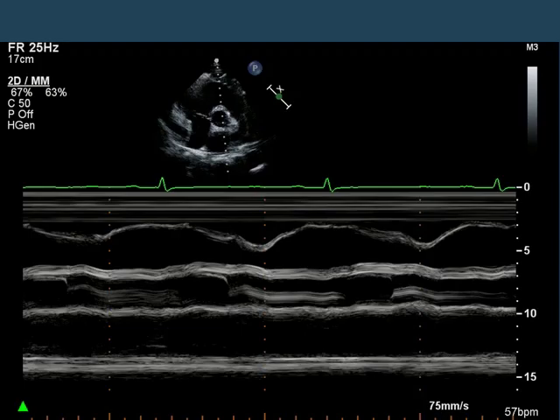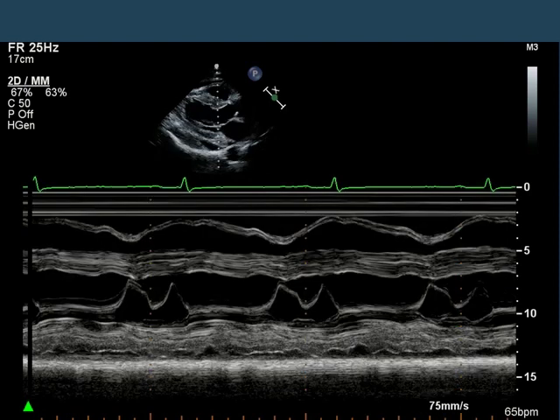You can see those again — just the M-mode. Take a look at where the aortic valve is closing, and see where the RVOT starts to come up. And in the mitral valve, you'll notice that the mitral valve always opens probably a good 100 or more milliseconds — I didn't measure it on the slides, but that's probably at least 100 milliseconds before the RV starts to get bigger.